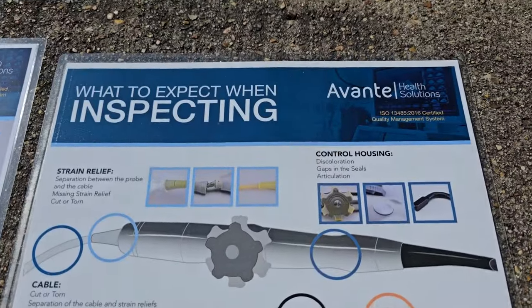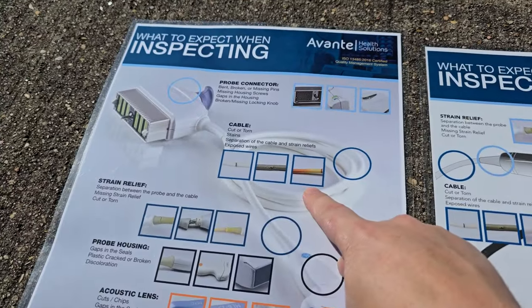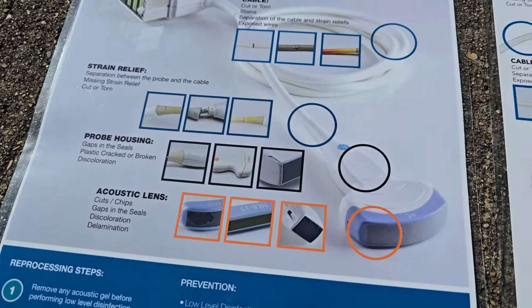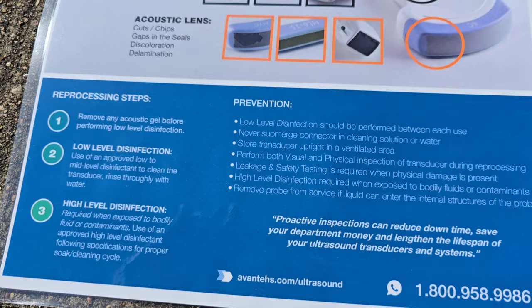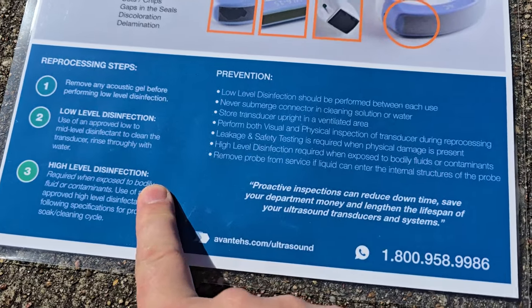It illustrates all the things to look for in ultrasound probes and TEE probes. It shows what to look for in cables, probe connector problems, strain relief problems, the acoustic lens — that's a big one — and obviously cracked housing, which are really big ones. Then down at the bottom, it shows you what you should do.